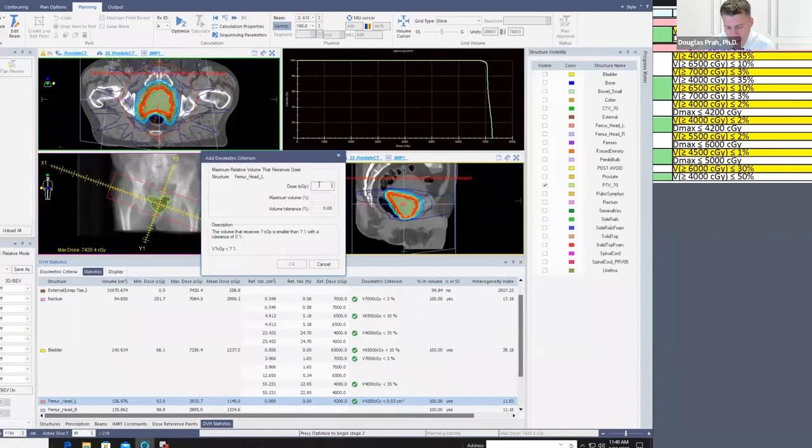So you can start out with a 0.03, or you can, when it's done, drop this total overall statistical uncertainty and reduce it a little bit, and it'll go away also. So in general, our physicians here, I've trained them all to understand that a max point dose in a Monte Carlo algorithm is a smaller volume. It's not a singular point, okay?